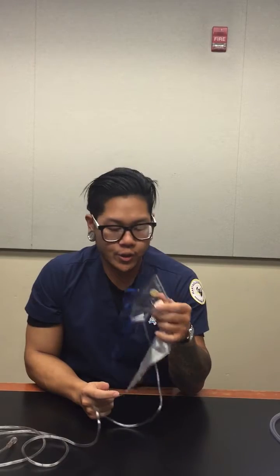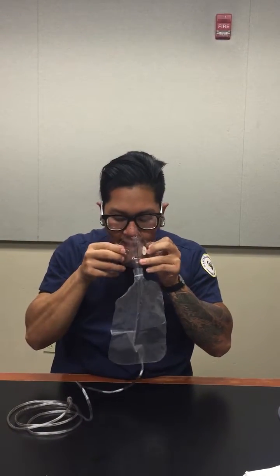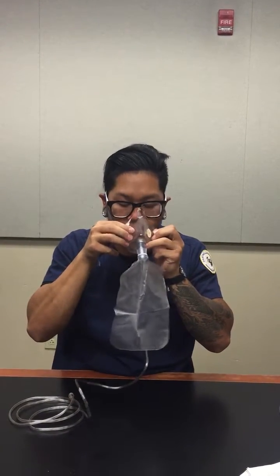And the disadvantages is that you can suffocate on it, you can vomit with it on and then choke. And the best use for a non-rebreather is basically emergencies and short-term therapy with high FiO2, and patients who are in a fire, who can have carbon monoxide poisoning and would need this. I already showed you how to put it on. You put it on the same, but I'll show you again. With a non-rebreather, it's going to have another little part right here which covers it. That's what makes it a non-rebreather.